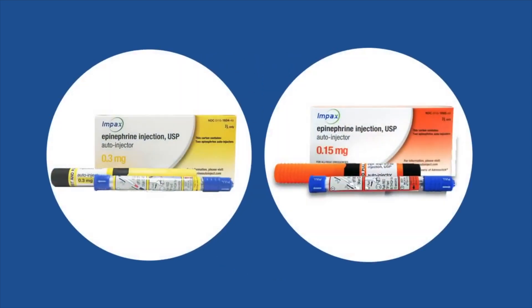Impax epinephrine auto-injectors come in two packs, so it's important to keep the injectors together. Having two auto-injectors on hand is necessary in the event there is a problem administering the first auto-injector or if the second dose is needed.